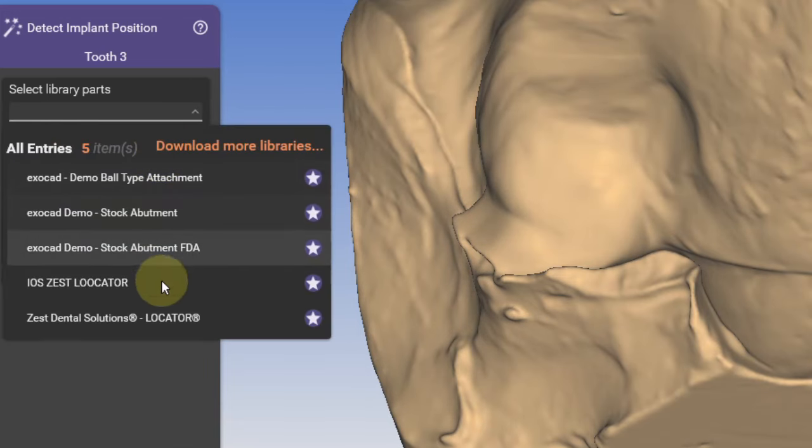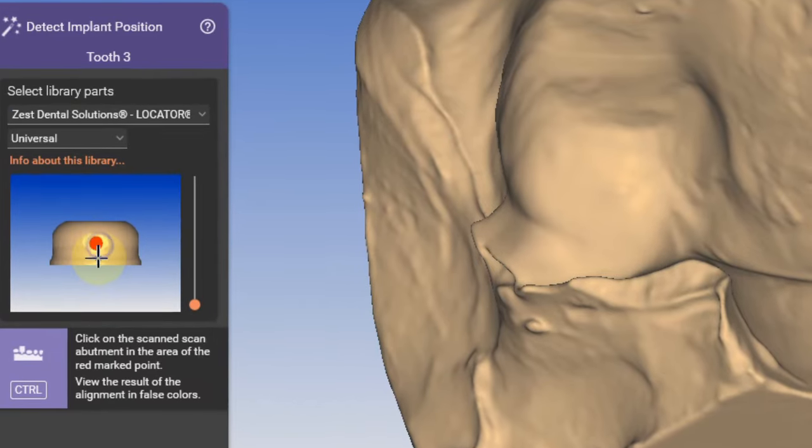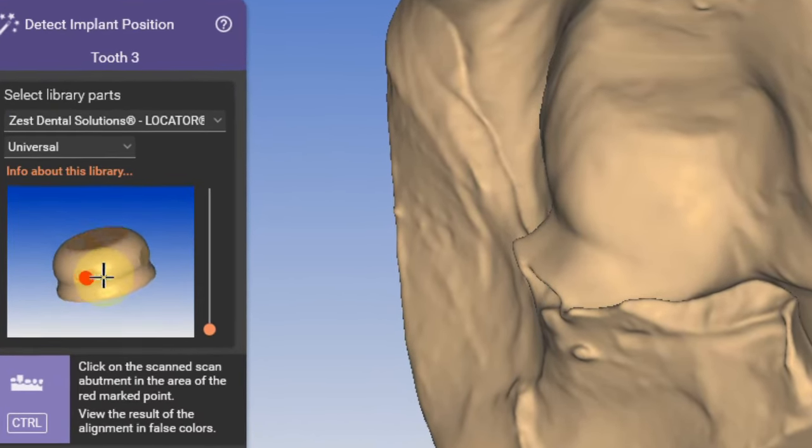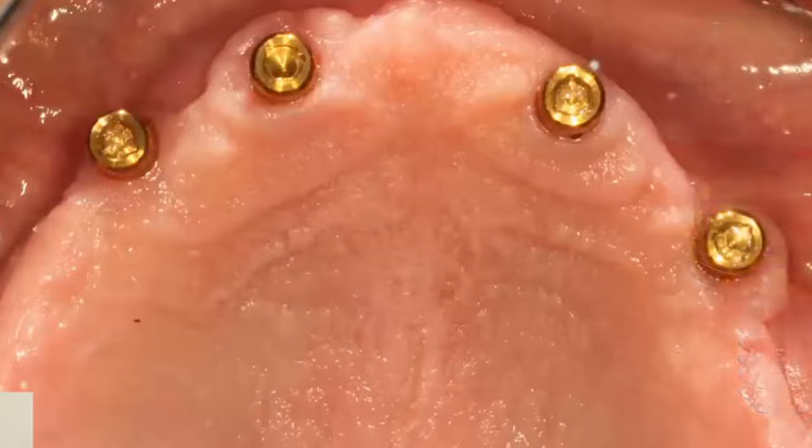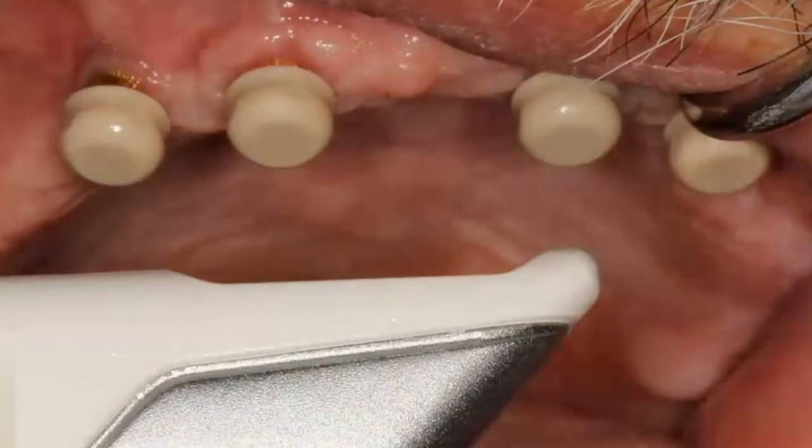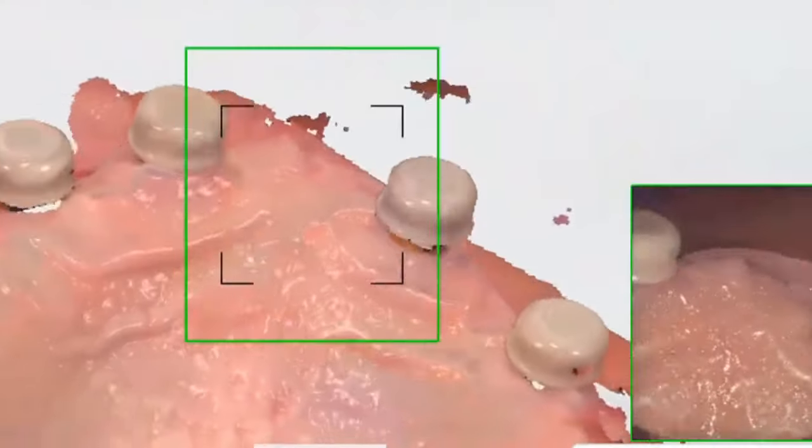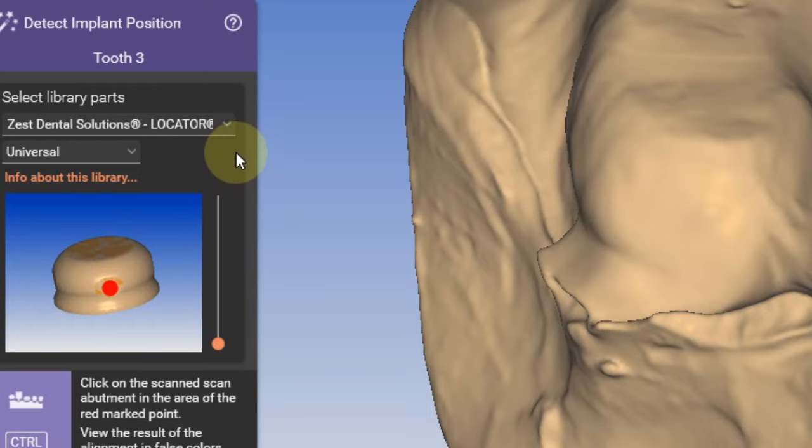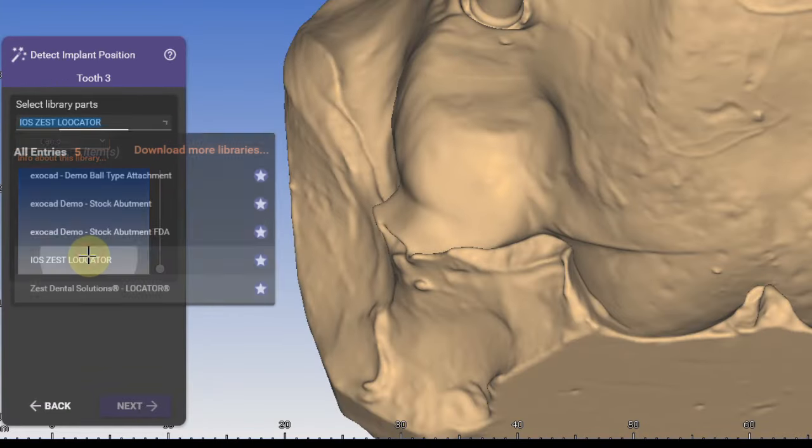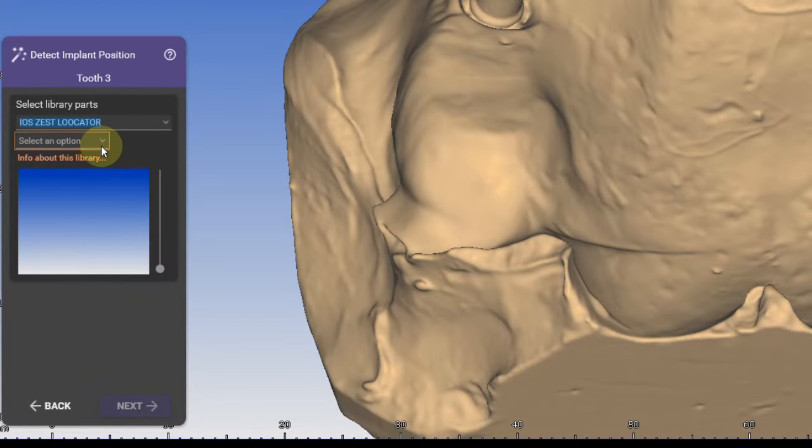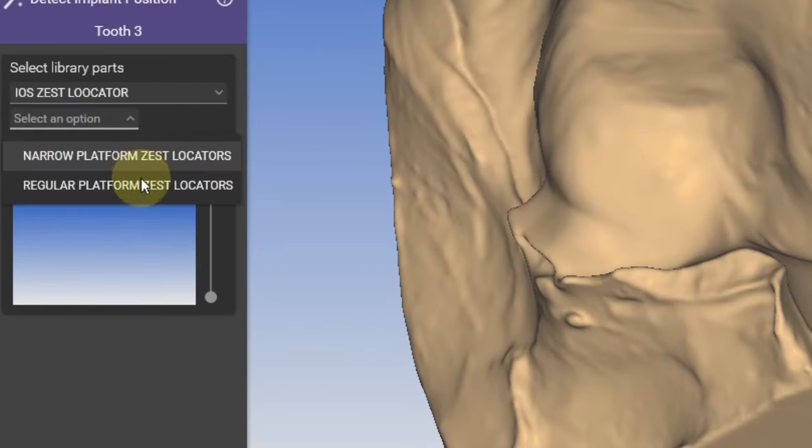Zest has its own locator cap libraries, but it does not come with model analogs and you have to have locators already in place and scan them with an iOS or desktop scanner.